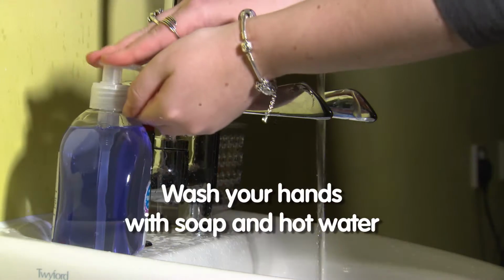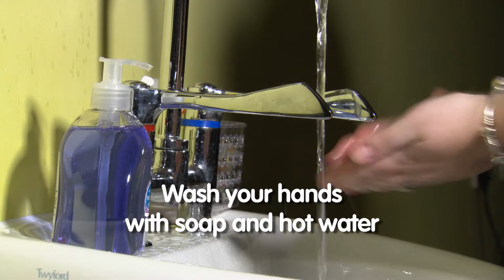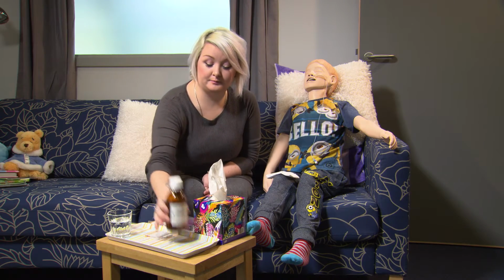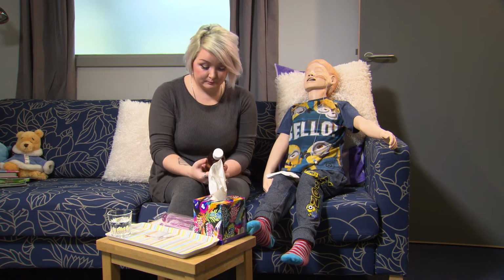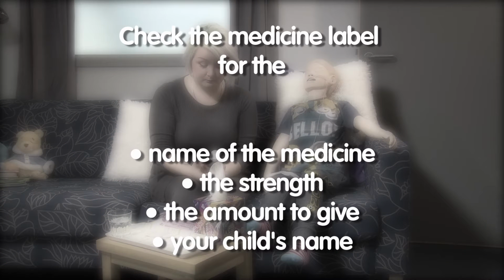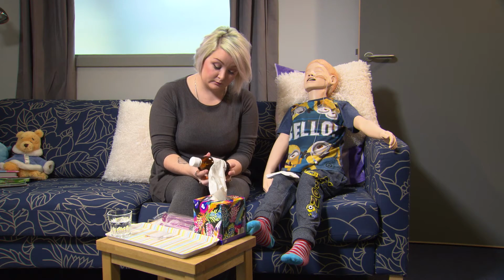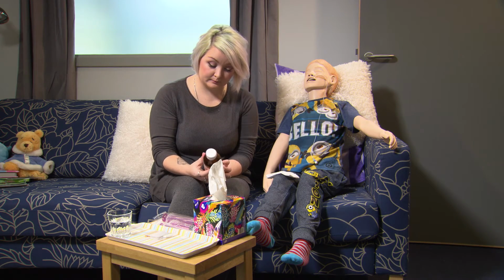Wash your hands with soap and hot water before starting. The first thing to do is check the label, to make sure you know which medicine you're about to give, and also check when it expires. This is especially important if you have more than one medicine to give. The label will have the name of the medicine, the strength, the amount to give, and your child's name. For older children, you can explain what you are going to do to help reassure them.